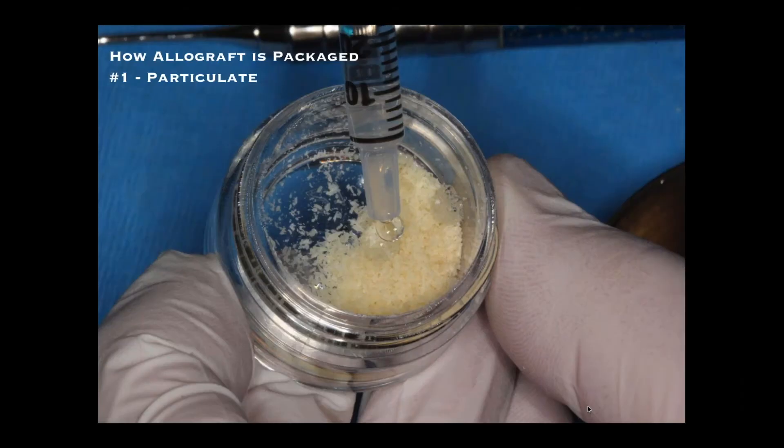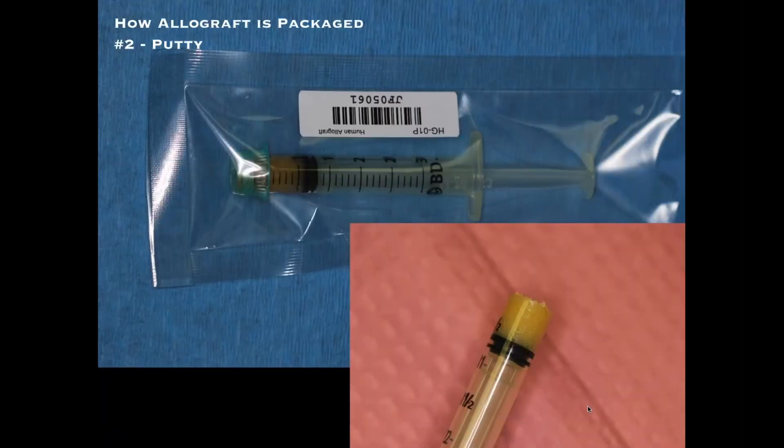Allograft comes as a mixture of mineralized cortical and cancellous bone — like a powder, usually 250 to 1000 microns. It's a dry powder that you can wet with sterile saline or sterile water to form a gel, which allows you to carry it to the site. You can buy it in different sizes: half a cc, a full cc, or more. It works very well, especially when the facial wall is missing. There's also allograft packaged as a putty in a syringe with a collagen binding material, making it easy to inject directly into a socket site.